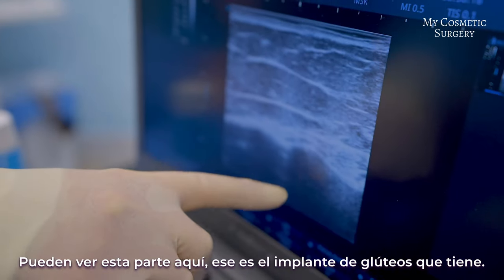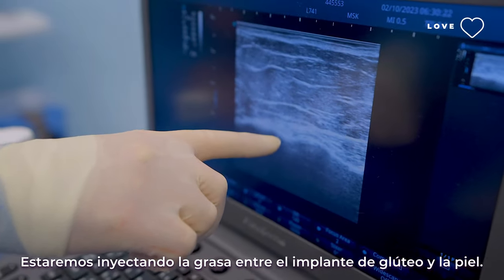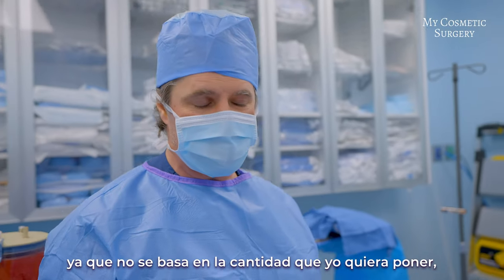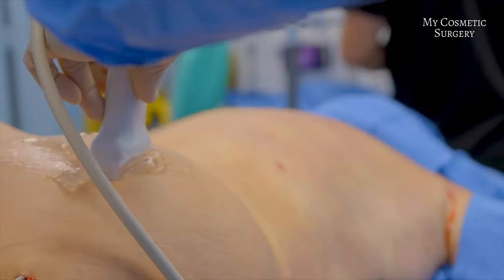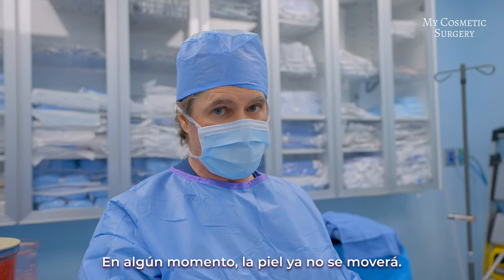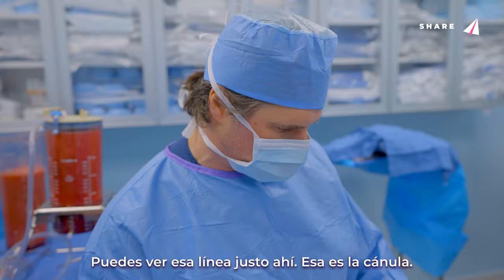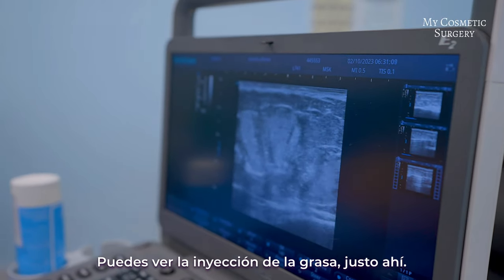You can see over here that's the top part of the skin, all this is the fat layer, and this part right here is the gluteal implant that she has. We're going to be injecting the fat on top of the gluteal implant but between the skin — that's all the space we have. The limitation for the amount of fat you can put in is not based on how much I want to put in; it's based on how much the skin can handle. As we inject, the skin is stretching, and at some point it won't move anymore. You can see that line — that's the cannula — and the injection of the fat going in right there.